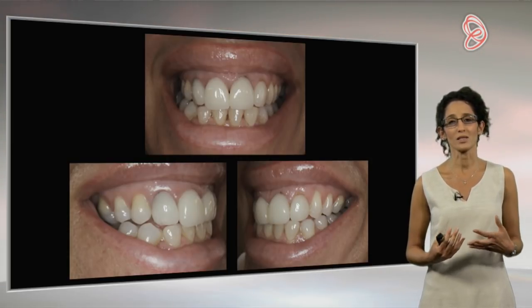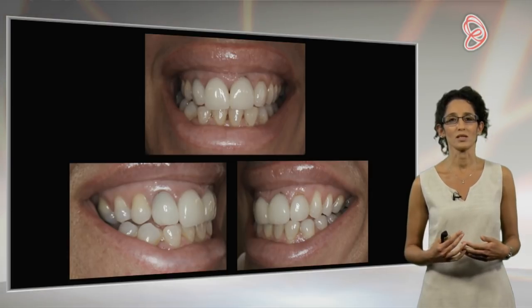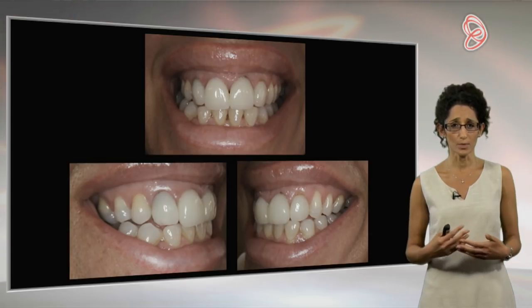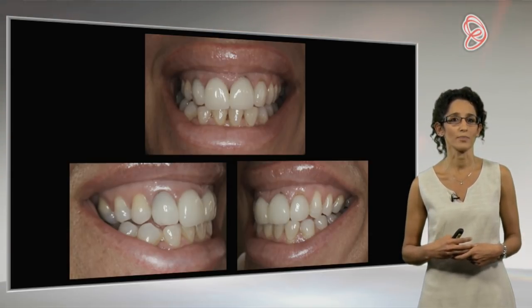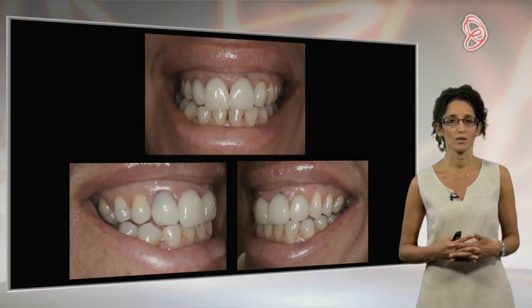And I think one of the biggest things to mention with lasers, which again I'll summarize at the end, is that with all these cases we tend to get much less pain, swelling, post-operative side effects due to what the lasers are doing in there. So I'll explain more of that as we go, but let's start off with this first case.